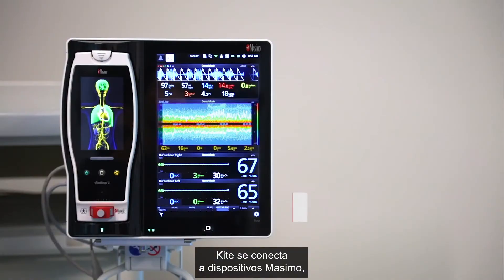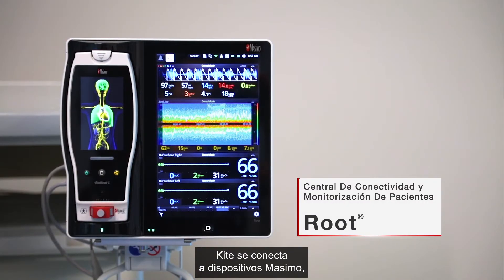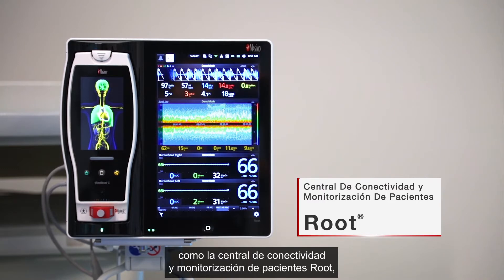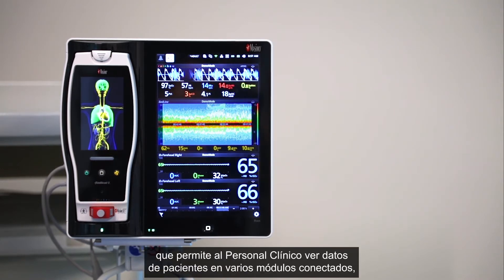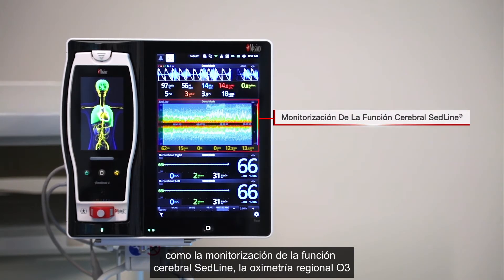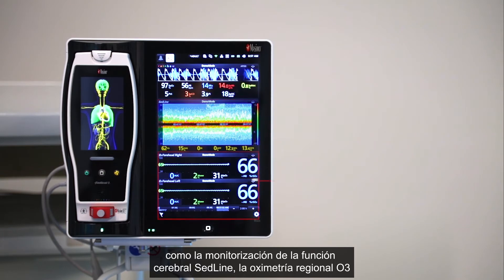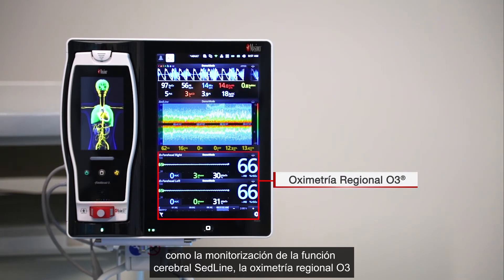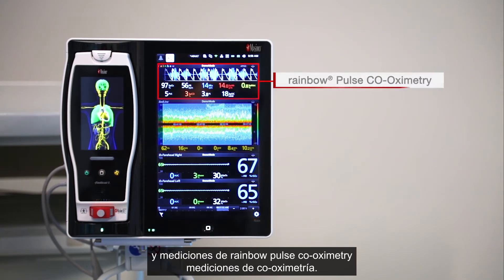Kite connects to Massimo devices such as the Root patient monitoring and connectivity hub, which allows the clinician to view patient data from a variety of connected modules such as SedLine brain function monitoring, O3 regional oximetry, and non-invasive rainbow pulse co-oximetry measurements.